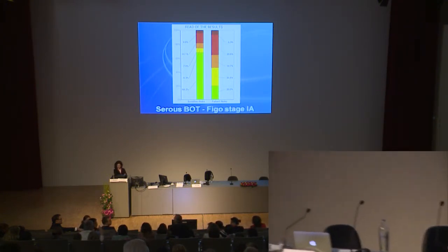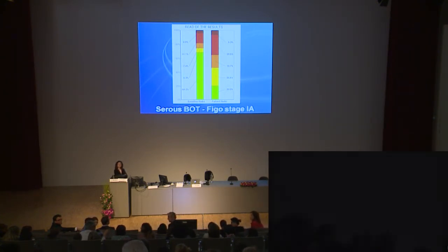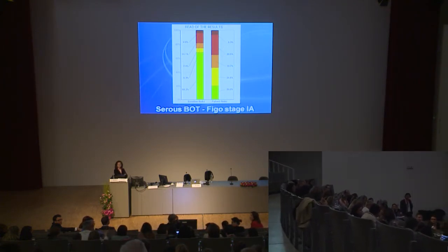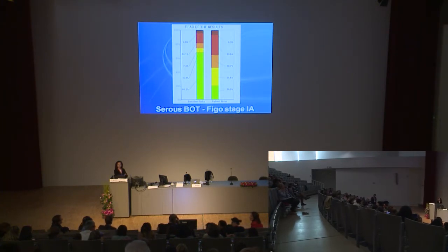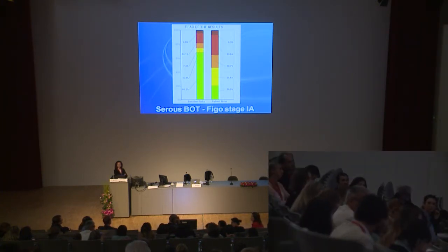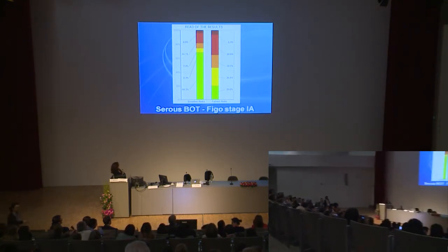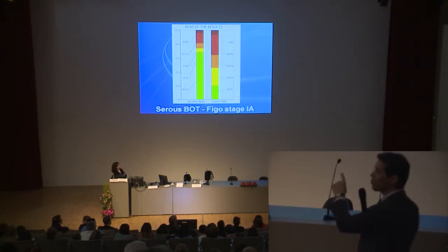I think this is a prime example of where the odds ratio would be helpful. I think you should have that given all the time, really, because that gives extra value to the assessment. Yes, I agree, but your left column will be different, and Ben will tell us the left column is the average of all IOTA patients.